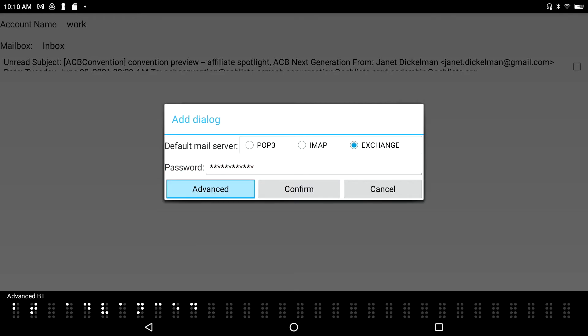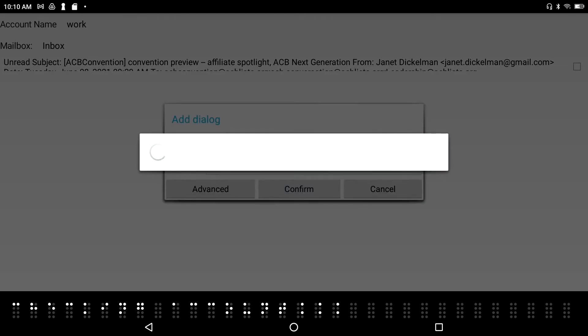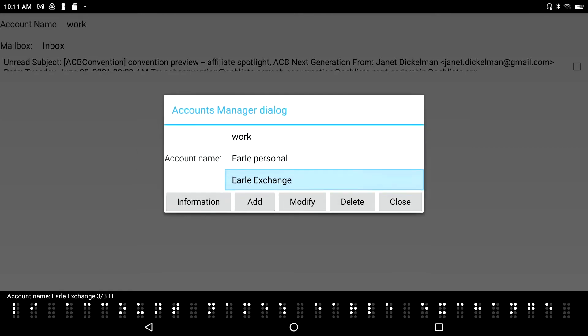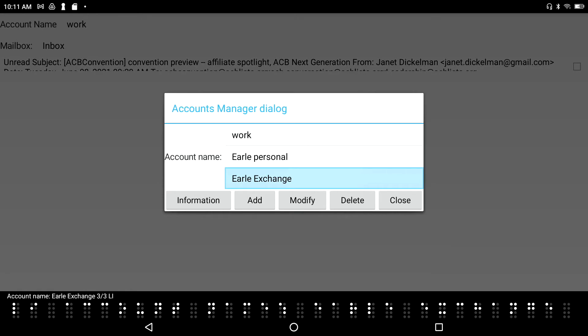I don't need the Advanced settings for the Exchange account, so I just confirm it. I see the progress beeps and full Braille cells dancing across the display while it processes — and the Exchange account has been successfully added.